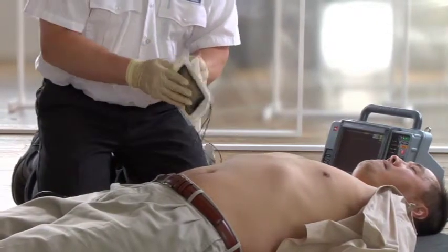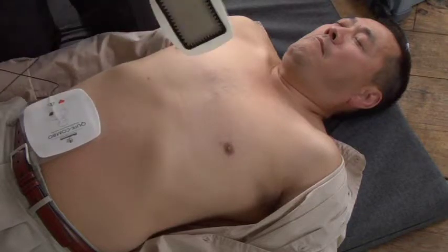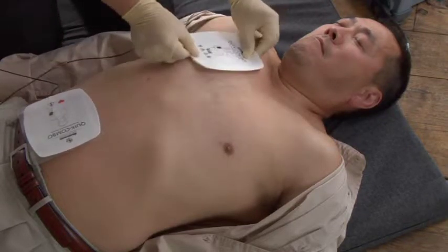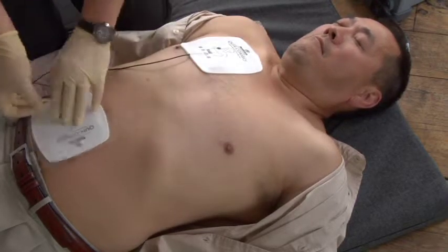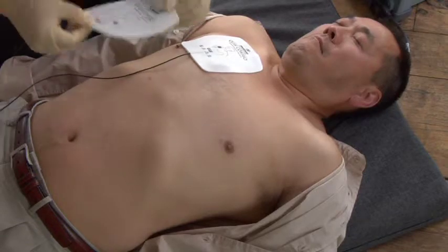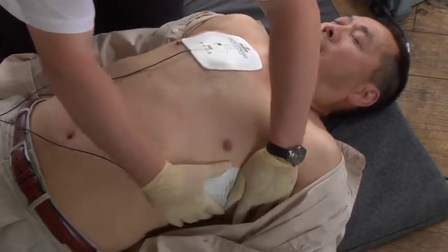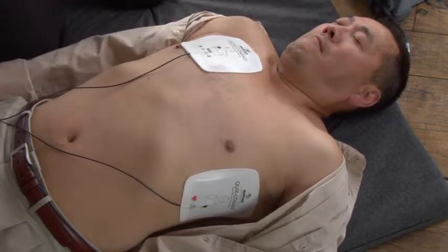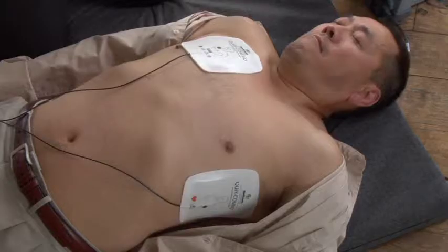Place the electrodes in the anterior lateral position. Make sure the electrodes do not touch each other or lead wires, ECG electrodes, dressings, or medication patches. Be sure the entire electrode surface adheres to the skin. If you know the patient has an implanted device, place the therapy electrodes away from it if possible. If you have to reapply therapy electrodes for any reason, replace them with new electrodes.